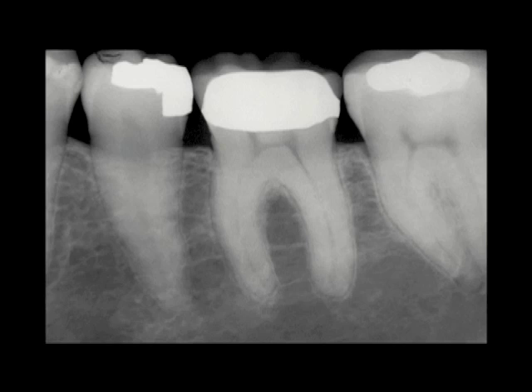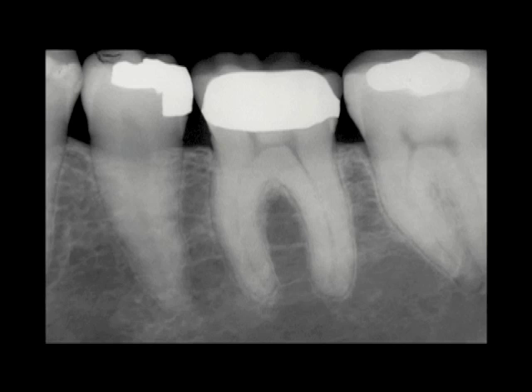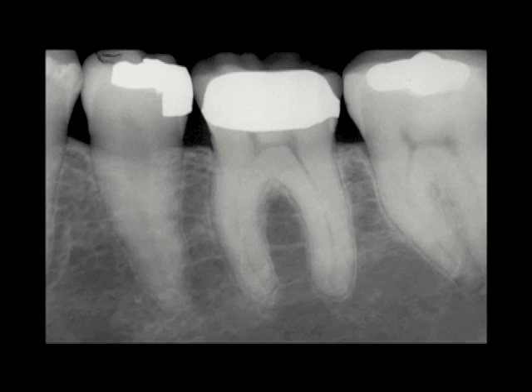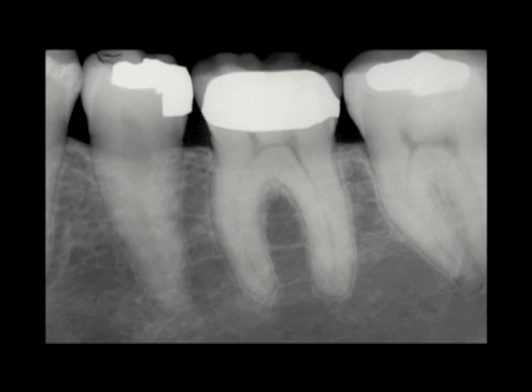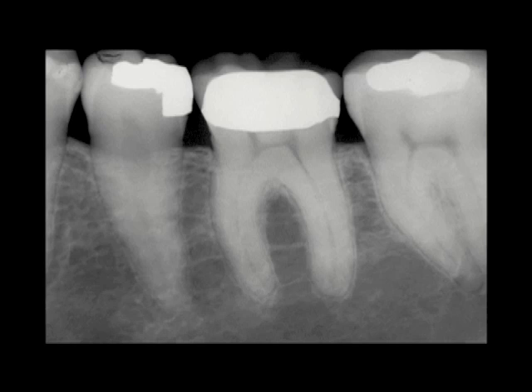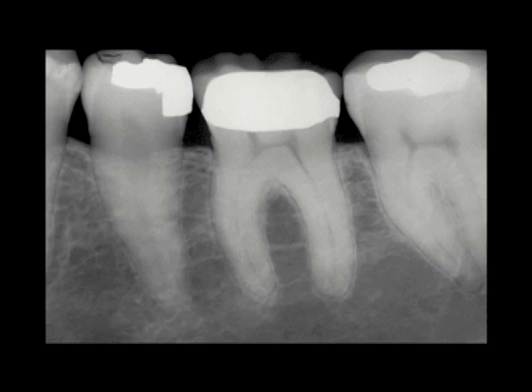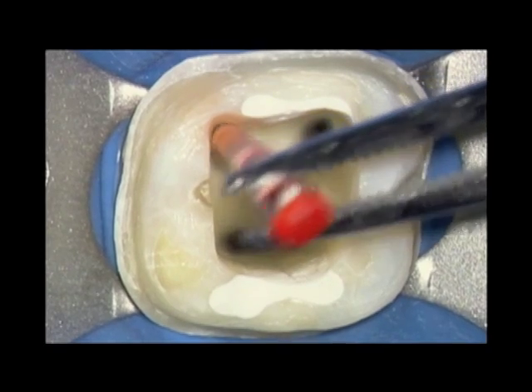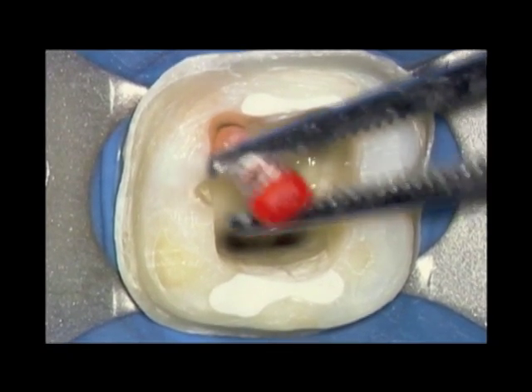Looking at this tooth, we're going to remove the crown — that's another lecture — but removing fixed dentistry has real advantages. Look at the tooth and begin to see the pack on the preoperative film. Look at those preoperative images and begin to imagine the flow of your obturation material, and you'll approach the game a little differently. If we zoom in here and look at a finished shape and disinfected system, we would fit a cone in the Schilder technique. The cone should slide to length and be confirmed radiographically — it's our last chance to make adjustments. Notice the heat wave moving through the cone to the terminus. Warm gutta percha can be compacted, and here we are with a pre-selected, pre-fit plugger moving GP and sealer into the anatomy, corking the apical one-third.